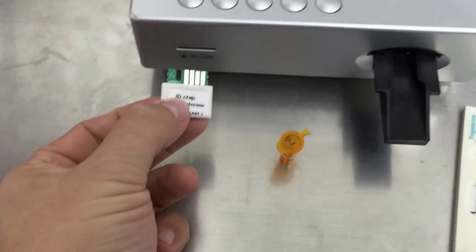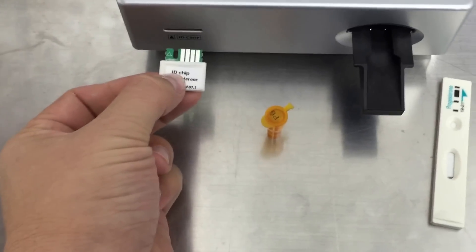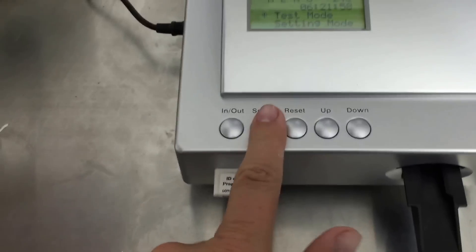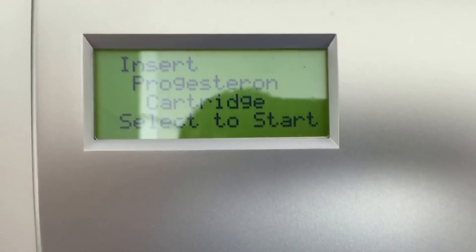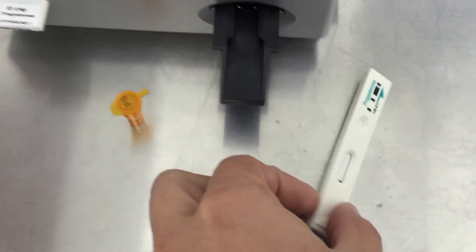After you've completed that, you put the microchip, which is the card from the box of the 25 progesterone tests. You put it in the machine, you press select, it automatically reads it, and then you get the strip.